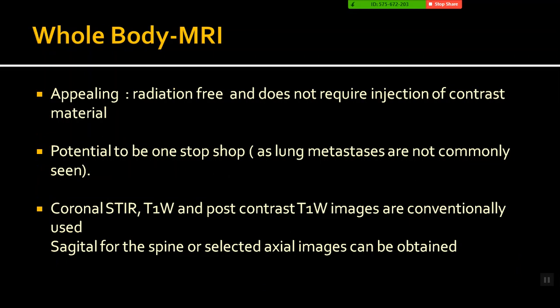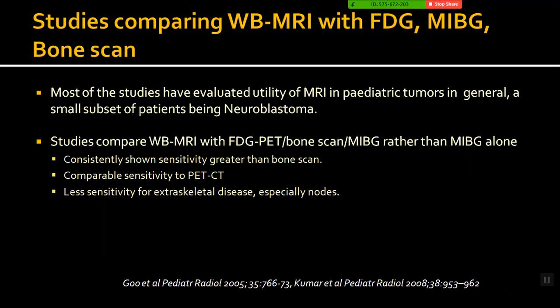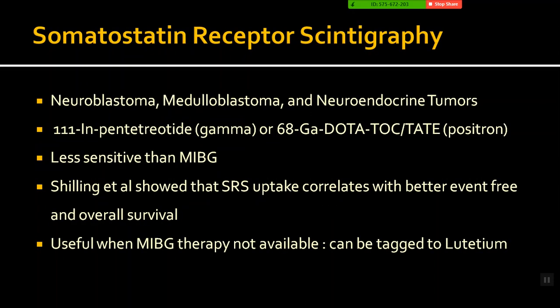And supplementary imaging, just one last word on whole body MRI. Everywhere it started coming in at some point of time. But in the study we did, we found that whole body MRI at that point of time was not so advanced. We just basically used coronal STIR and T1 weighted images. We found that PET-CT was superior in detecting nodal and liver metastasis as compared to whole body MRI, because they can be really, really small, right? So there are studies which have compared the two, but it's not a standard of care. You can just write it to complete your answer.